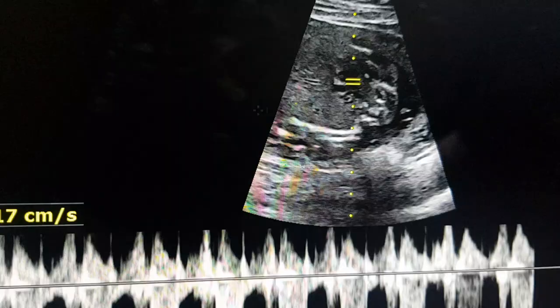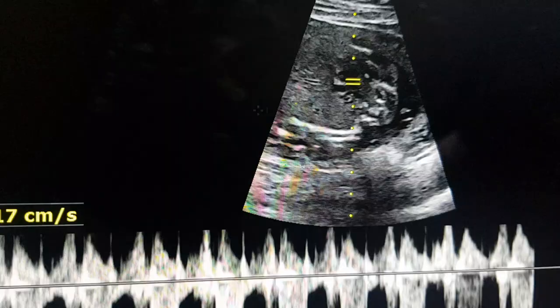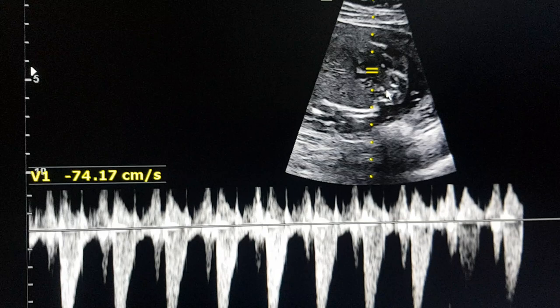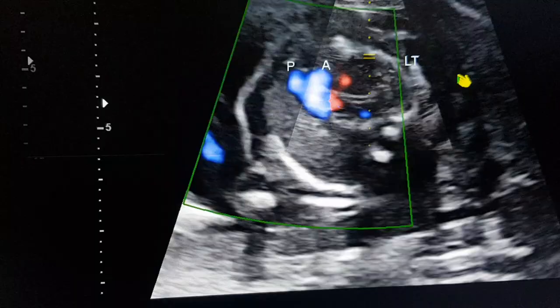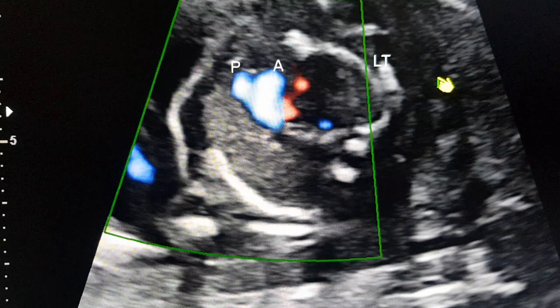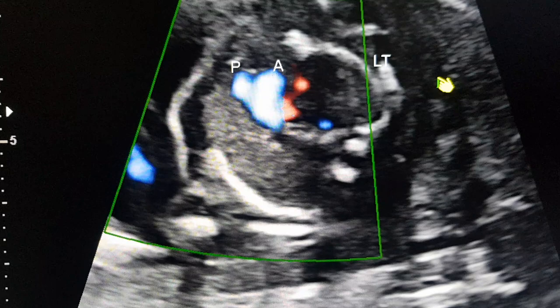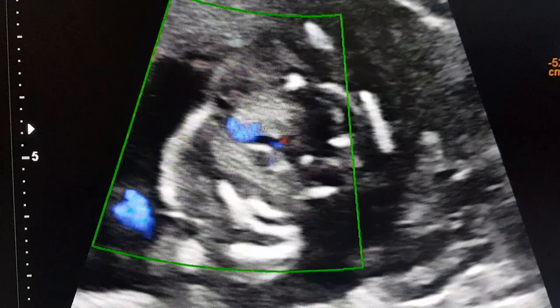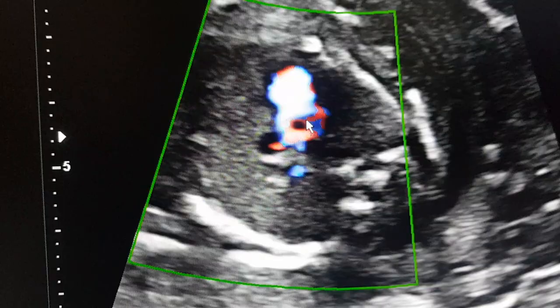This is the ascending aorta coming from the LVOT — we have measured it — and then we take a Doppler waveform of the aorta which is 74 centimeters per second, normal. Then we go to color Doppler and things become very clear: that is the ascending aorta, that is the pulmonary artery, and you can see the pulmonary artery and aorta are parallel to each other — great vessel crisscross is absent. There is transposition. On color Doppler showing the inlet and the outlet, you can see that both vessels are coming from the left ventricle and both vessels are parallel to each other.